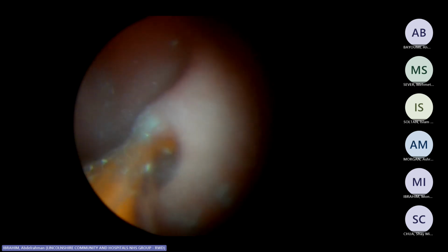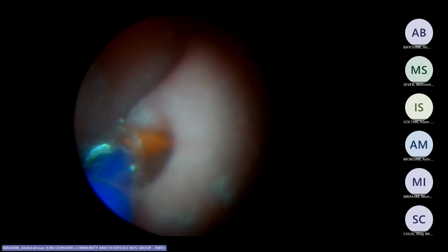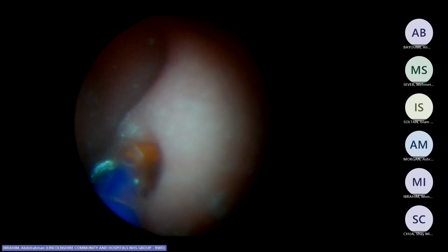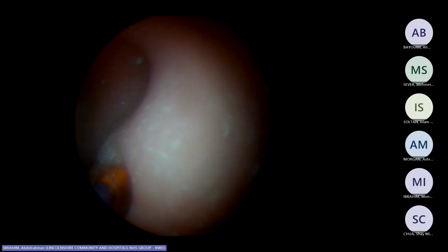Not sure if it's going to go in there. Is this designed to go in? Yeah, it is. It should go. You just need to apply a bit of force because of the material. Don't do this in real life, okay? Don't do this at home. If there is any force, don't try to force it. You'll create a false pathway, and then you did the dilatation, the patient wakes up, and you have surgical emphysema with the first cough. Did we see it? We saw it, okay?